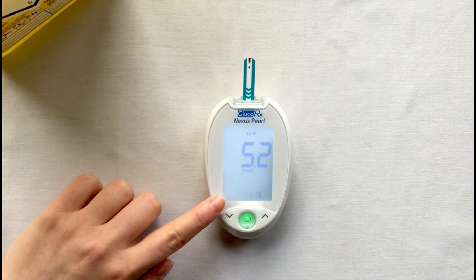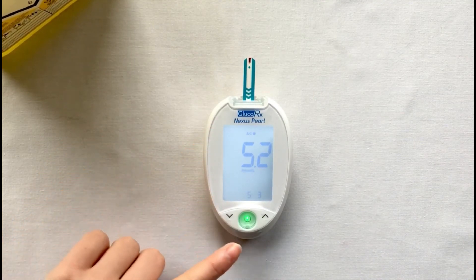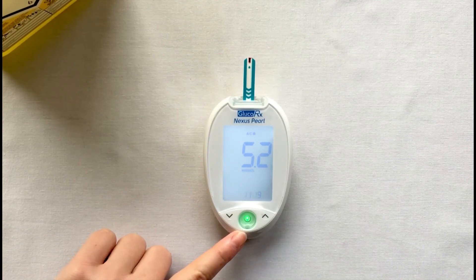If your reading has fallen within your specified range the middle button will turn green. However if your result has fallen out of the range the middle button will turn red.